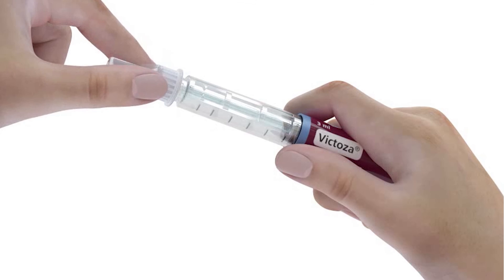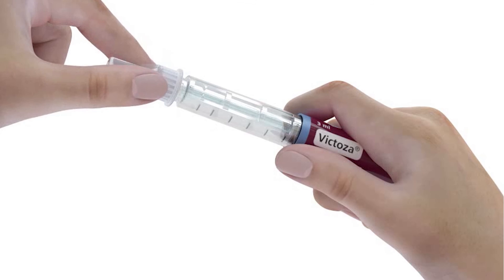Remove the needle after every injection to ensure continuous, painless and accurate dosing. Then put the pen cap back on and store Victoza pen at room temperature until your next injection.